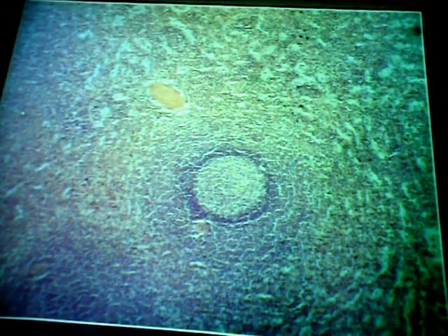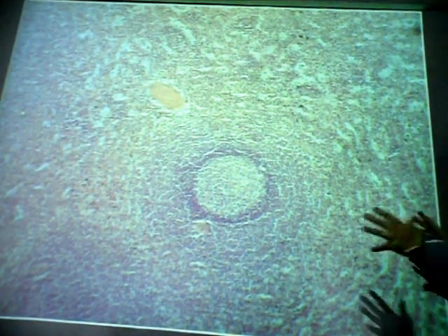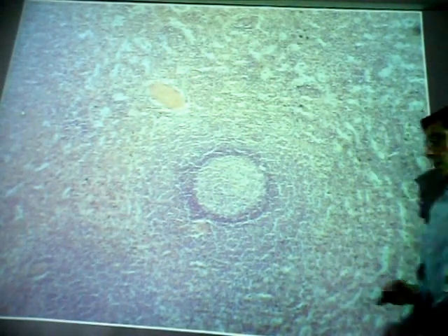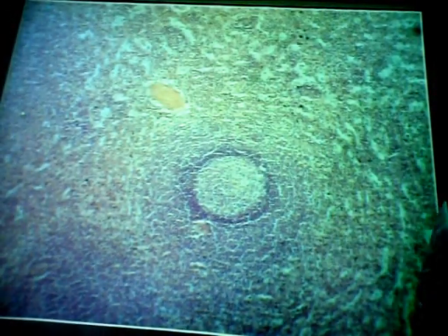Okay. Now you've got lymphocytes here. They mature, then they migrate out into the cords, the splenic cords, and that's where they come in contact with foreign antigens. They become sensitized and do their thing. Okay. Any questions? Okay. Again, make sure you know the function of these organs.